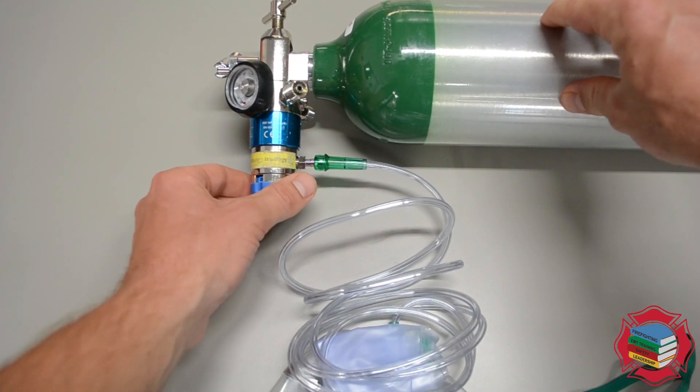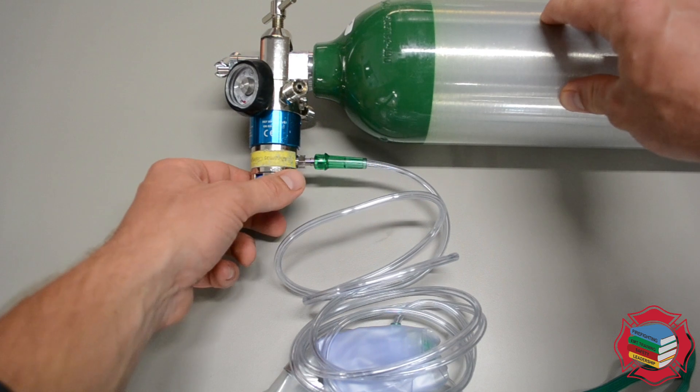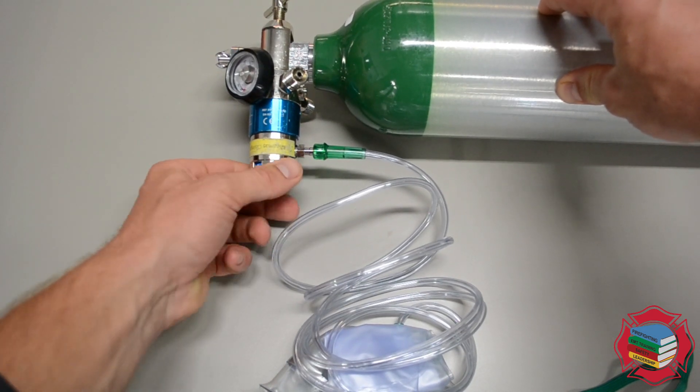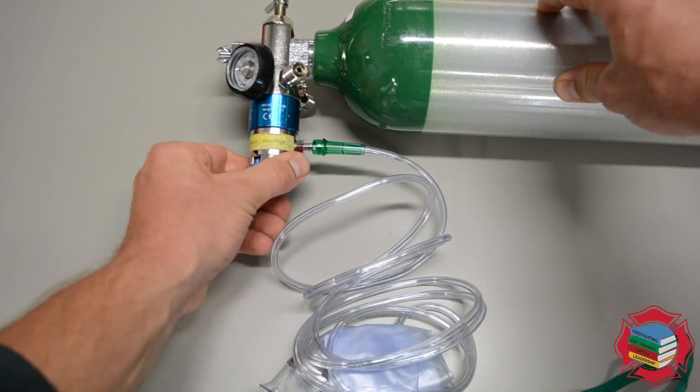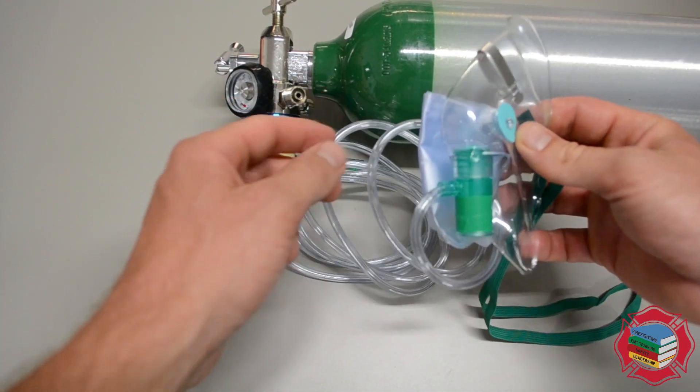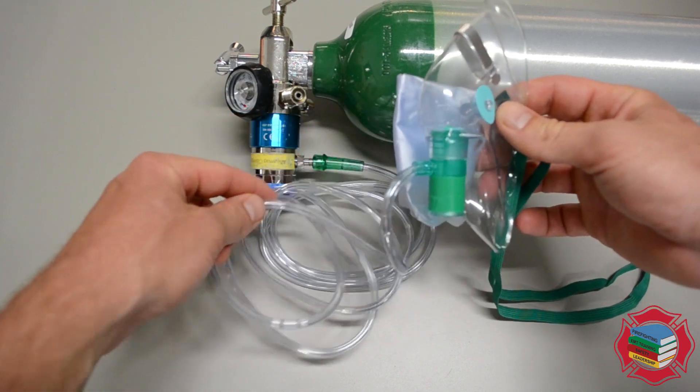You want to be able to take this off when you get into the ambulance and put them on the main O2 tank. Then we'll turn this — I'm going to turn it straight to 15 liters a minute for this demonstration. I'll then take the mask — you see how this bag is all folded up.